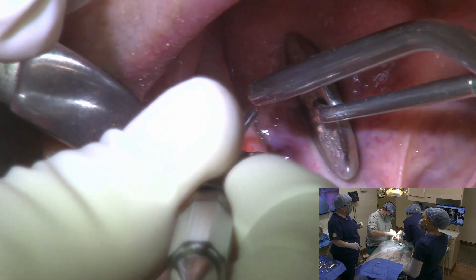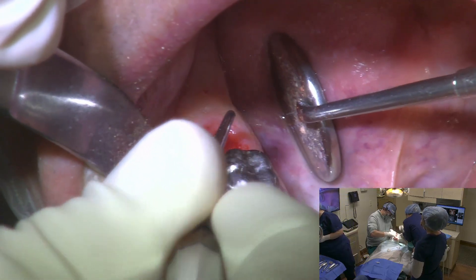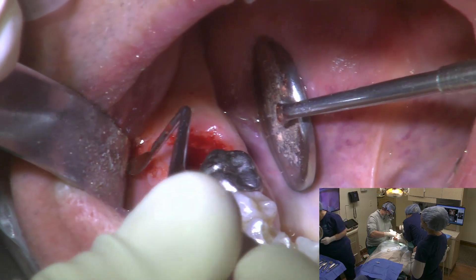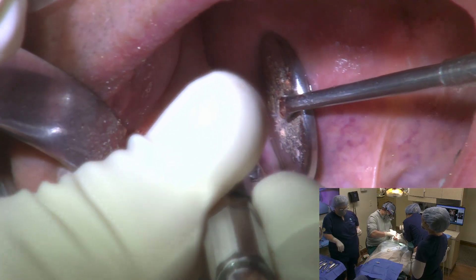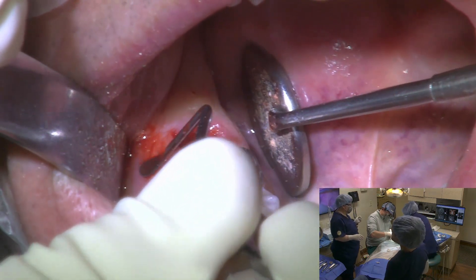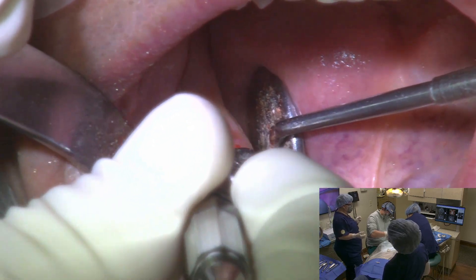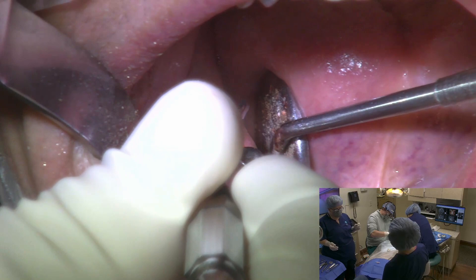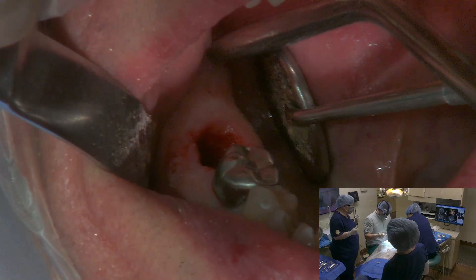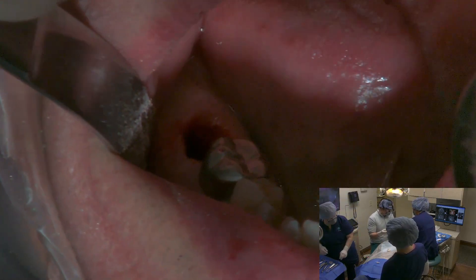I am going to be pragmatic here and I am not going to put our implant in today. We're going to just graft, because this soft tissue and this little hole is going to prevent things from healing properly. Plus you've lost probably four or five millimeters of bone on the outside of this tooth, and where the bone is on the inside, we'd have to bury the implant so far that it would create a problem with the implant long term. So we've got good solid bleeding, so what we're going to do now is just go ahead and put our graft in.